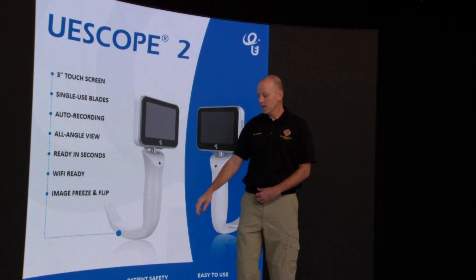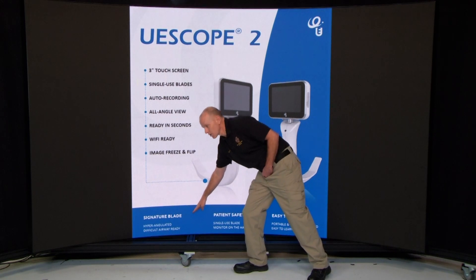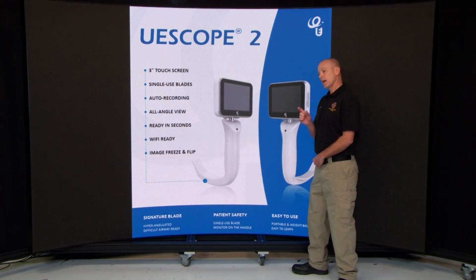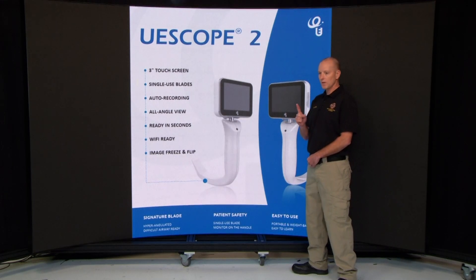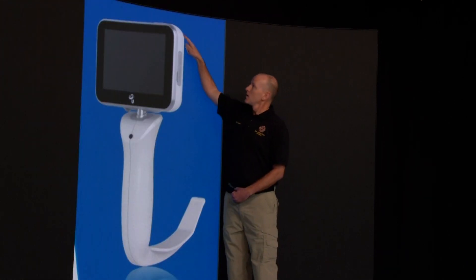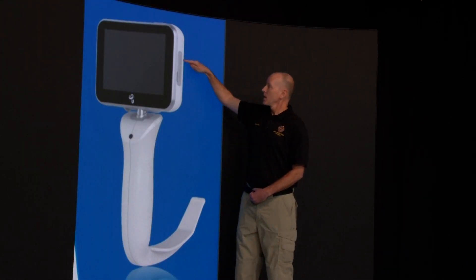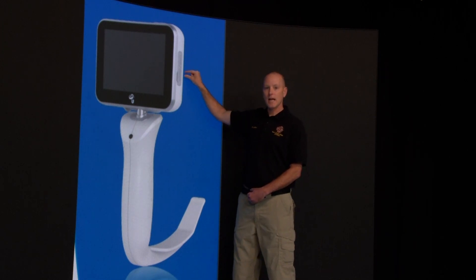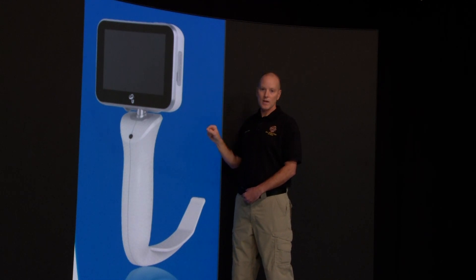At the bottom, each of these blades — and we'll go over this more specifically in a minute — they're hyper-angulated, which makes it easy. You have one blade for either simple intubations all the way to those difficult anterior patients, obese patients, or patients with long necks. The power button is on top, and on the side is your UC connector.